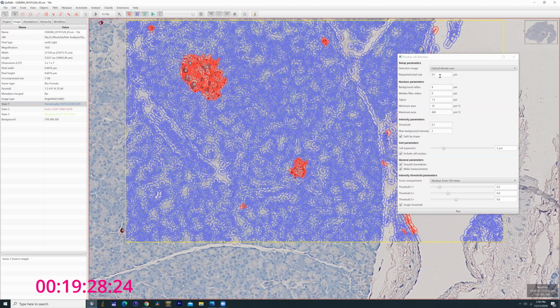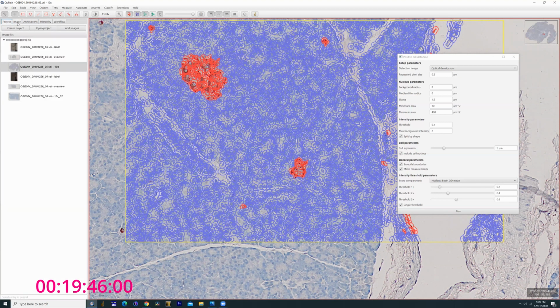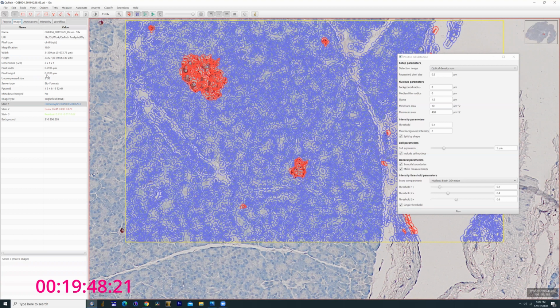It's like a subset. Oh, sorry, actually, let's try annotations, hierarchy. Okay, let's try under annotations. I thought it was originally listed there, but anyway, maybe it is under a project image. It's giving you the idea of the relative pixel thickness. I think the actual baseline pixel thickness is at one. Here, let's try 0.6916. Run.